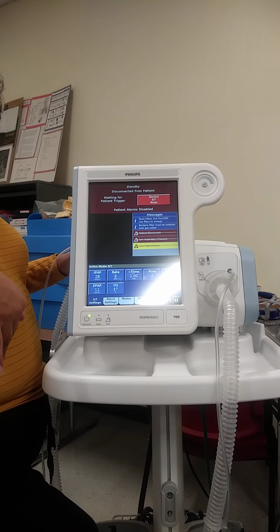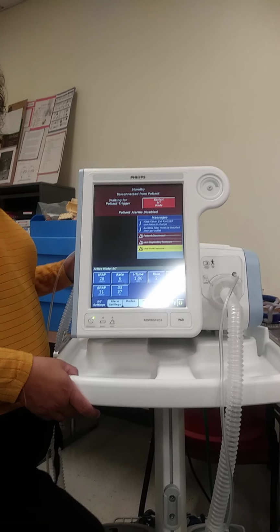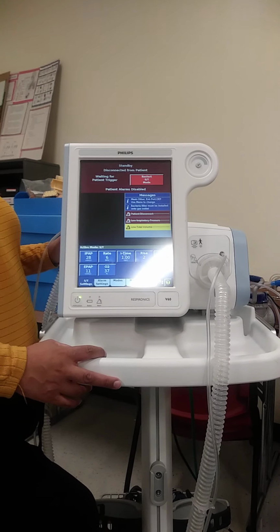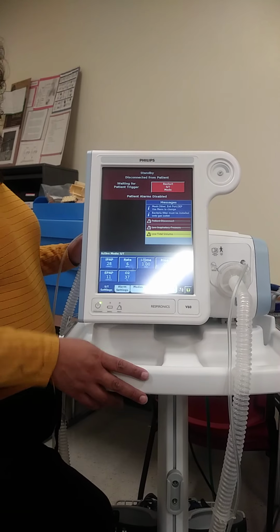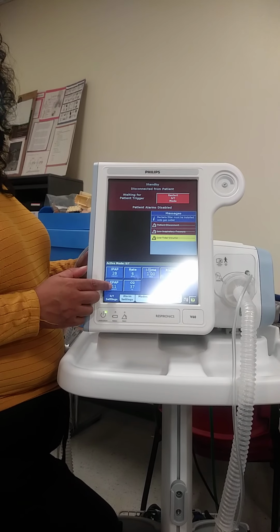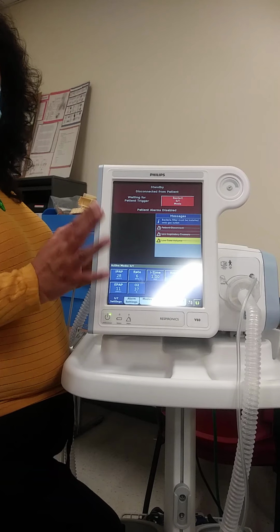Washing out the nitrogen in my alveoli, causing absorption atelectasis. Yeah. So just know that high levels of FiO2 for long periods of time can lead to oxygen toxicity. And when you're at 60-70% and you're still having problems oxygenating, you have to think of pressure to help keep your alveoli open. So I may have to adjust my pressures.